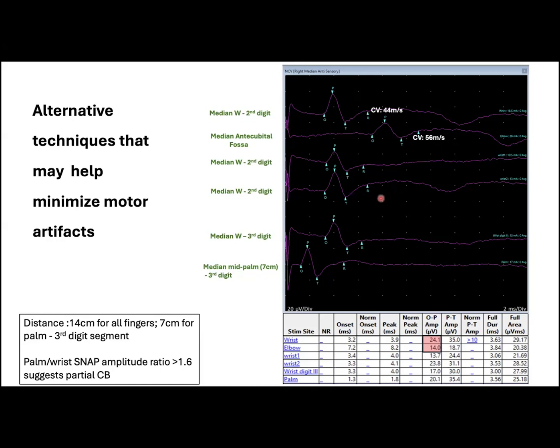We can see that with submaximal stimulation, the snap has reduced amplitudes, almost half the size of the first one, and conduction velocities that are a bit slower. And everything improves when we gradually increase the stimuli, as you can see here.